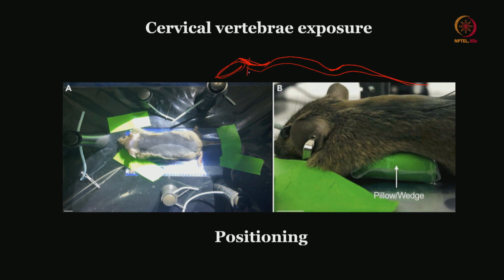So if you are doing a surgery here, then you have to make sure that the cervical vertebra is on top. Otherwise there is crowding of the vertebrae, and all the spinous processes will be together, and it is very difficult to expose and do the laminectomy, for a simple reason: you can consider this as multiple rings which are crowded like that.